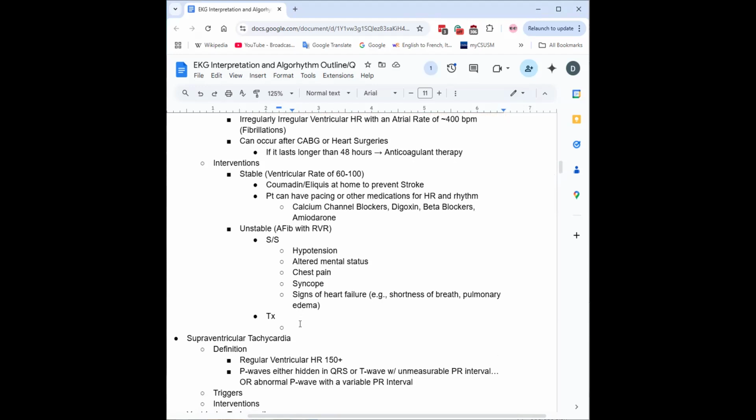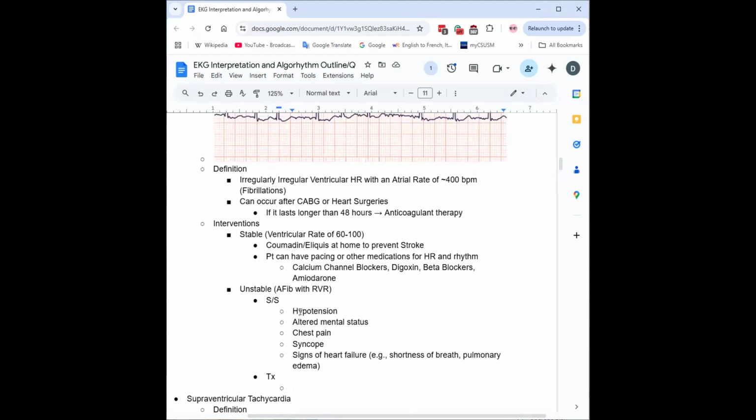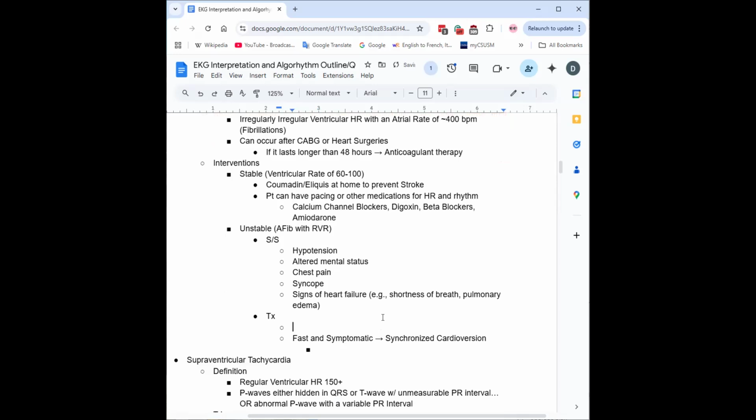But besides that, if I am awake and conscious, I have hyperthyroidism and I went into AFib, and you walk into my room and say we're going to shock you, quite literally shock you, and synchronized cardiovert you back into a normal rhythm, am I going to like that? Hope not. If some of y'all do, I'm worried about you. You should not like that. This could be considered quite painful. Our synchronized cardioversion, it's quite a lot of joules that we're putting into them.